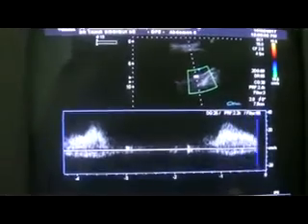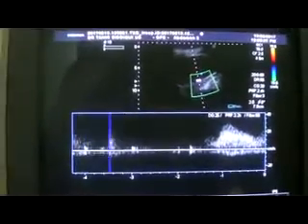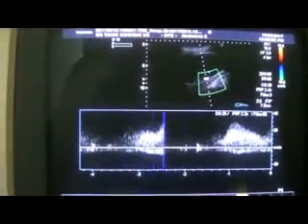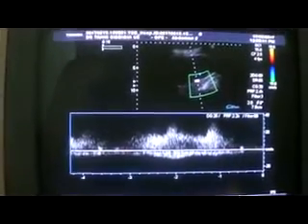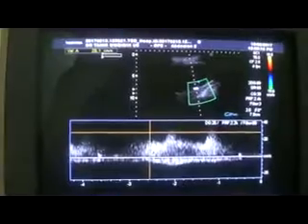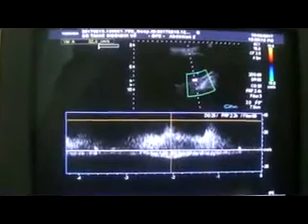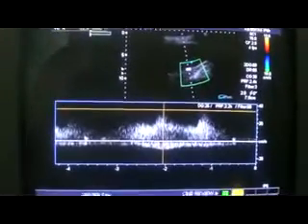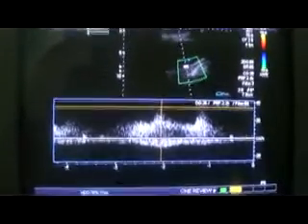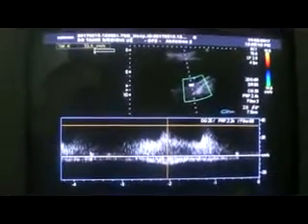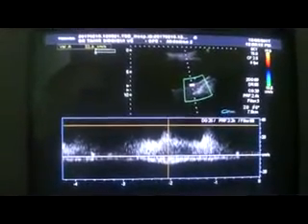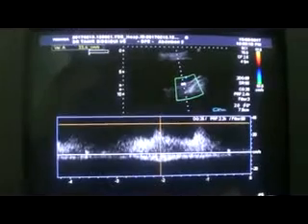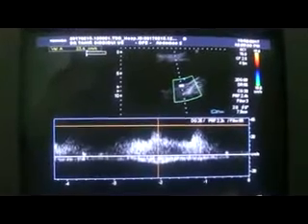The patient is unable to hold the breath properly. But if I try to get the velocity of the splenic artery, it is approximately 33.6 centimeters per second.